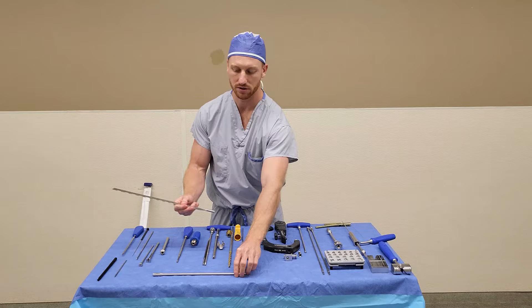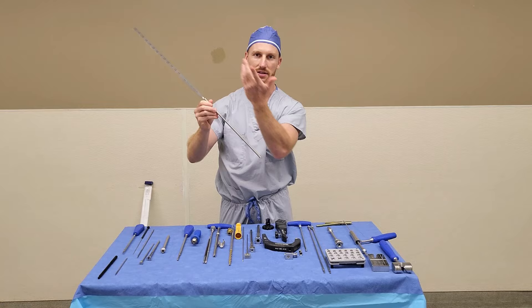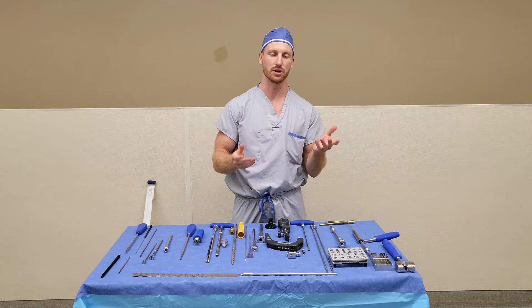At that point, you are ready to measure your nail. Take your two measuring devices, slide them into each other, and hand it up to the surgeon. He or she will put it over the ball tip guide wire where the wire ends — that is the length of your nail. You now have the diameter and the length of your nail to go grab it off the shelf.